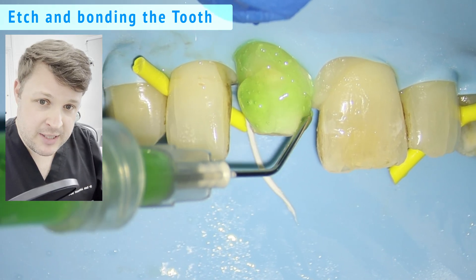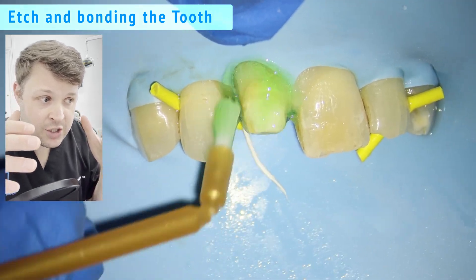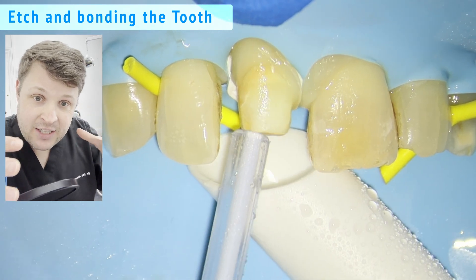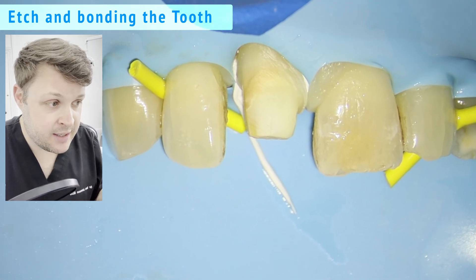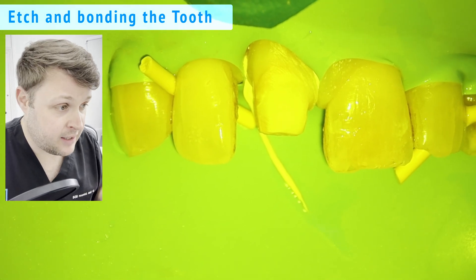It's a little different in this case because usually what we do is tuck the rubber dam into the PTFE tape and it gets a nice margin. But because the margin was so high, I've had to manually use my finger to move the rubber dam out of the way. So we've etched and now we're about to bond.